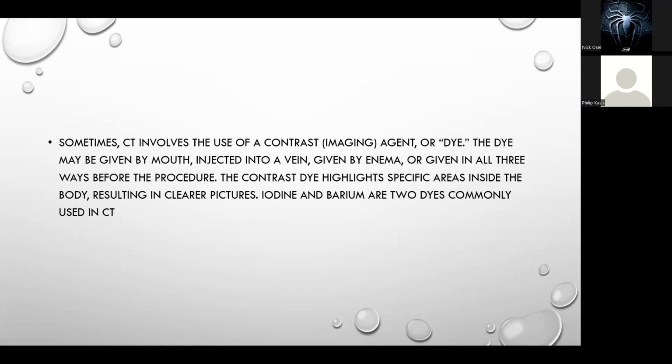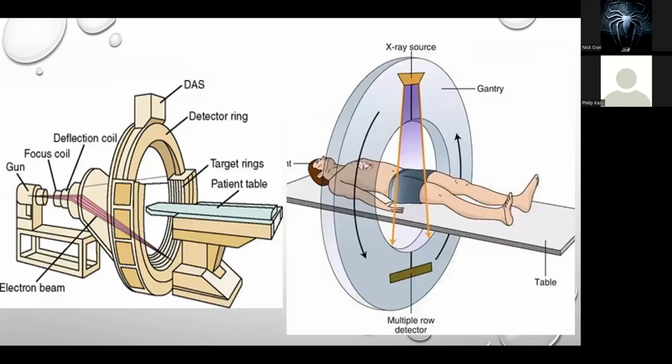So that is the use of CT contrast. We'll look at a few pictures later. You can give it by mouth to swallow, IV, or as an enema.